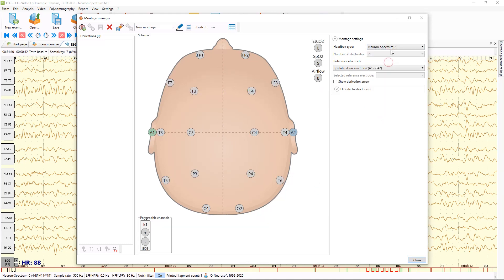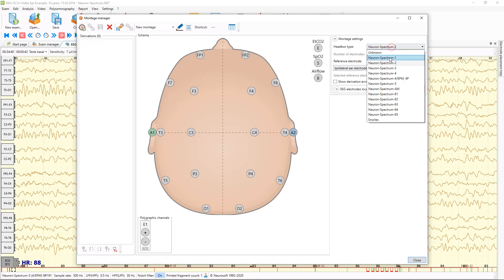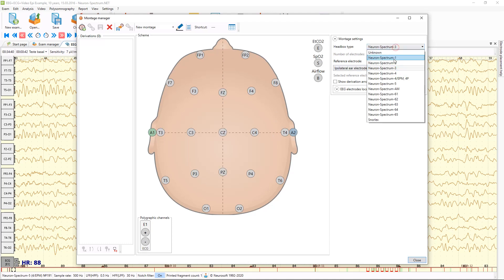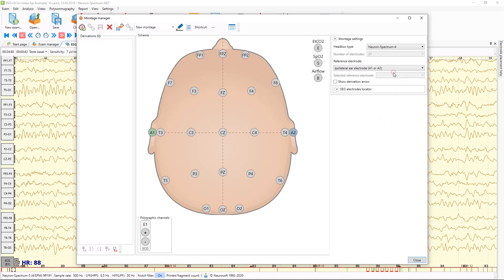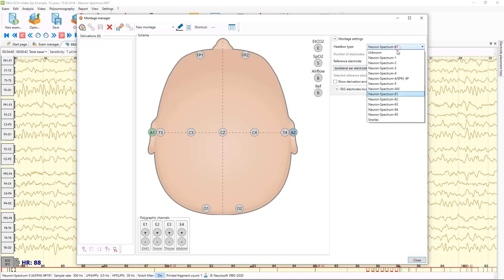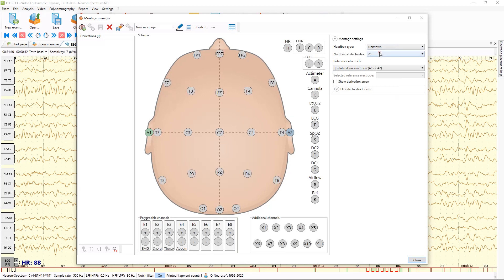According to the selected device, you will see that the number of available channels will be different. By default, the device is unknown, and we can create a montage for each device.